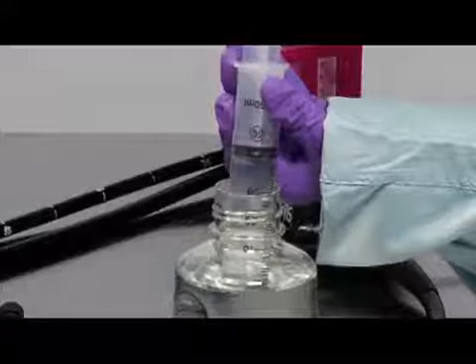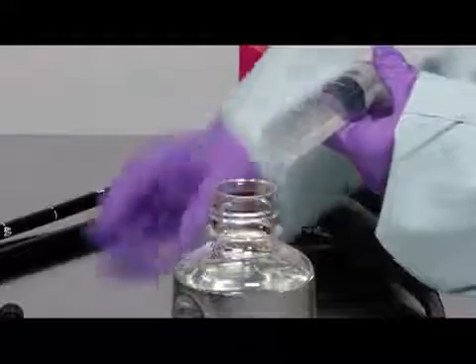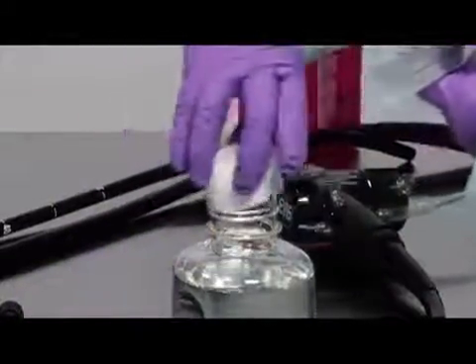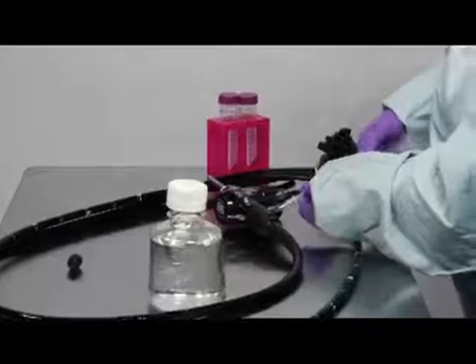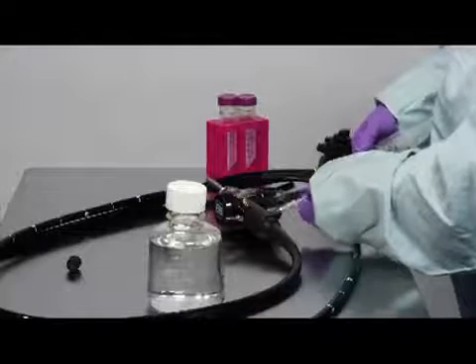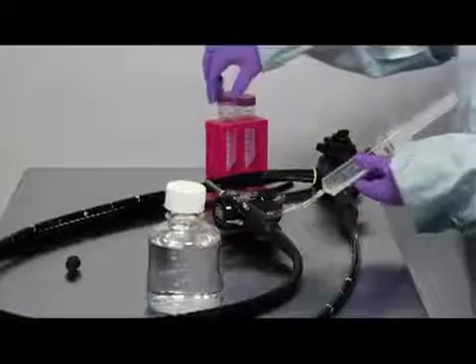You always want to make sure to cap anything that you don't want to get dirty, so I always cap the water off before you move on to your procedure, just in case something spills. You'll be able to catch some of it at least. In this alternate protocol, you've got the green plug keeping your sample from leaking out through the suction valve.